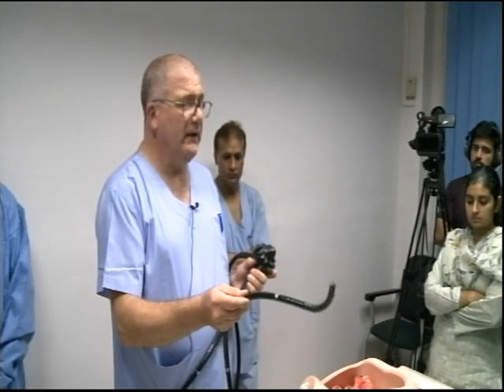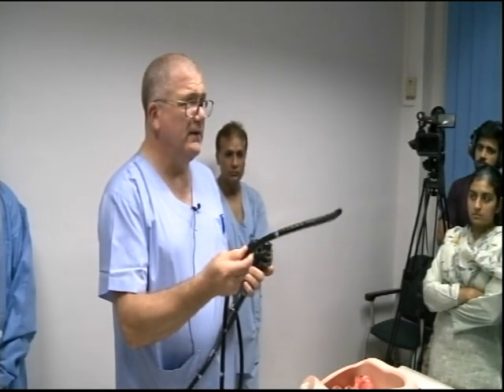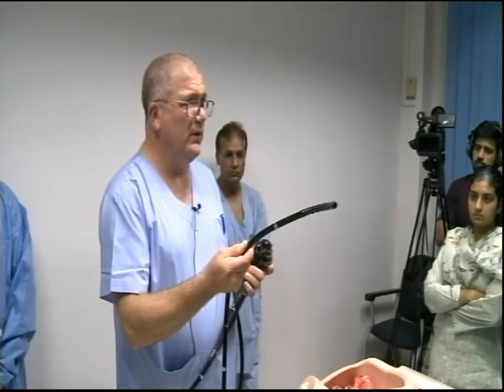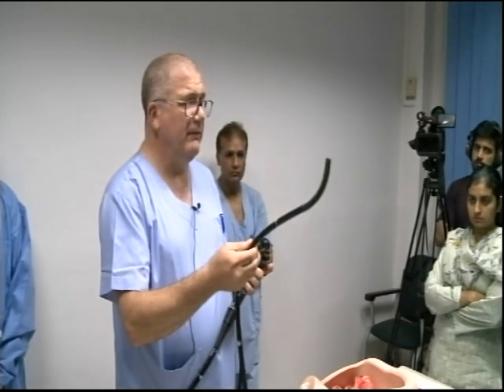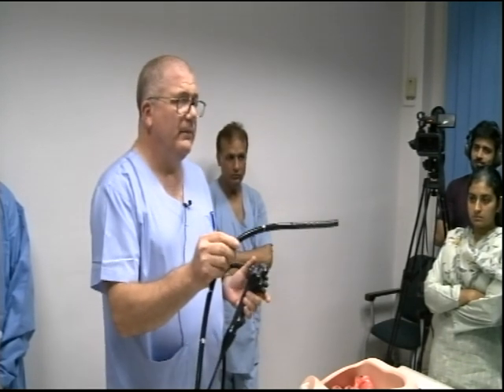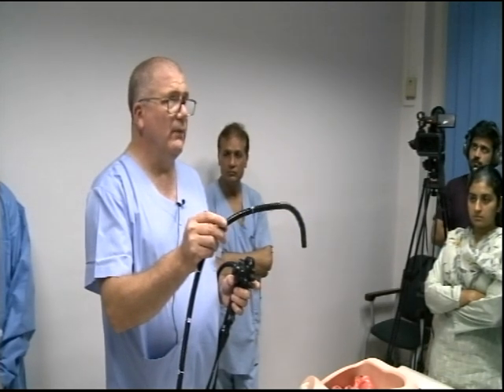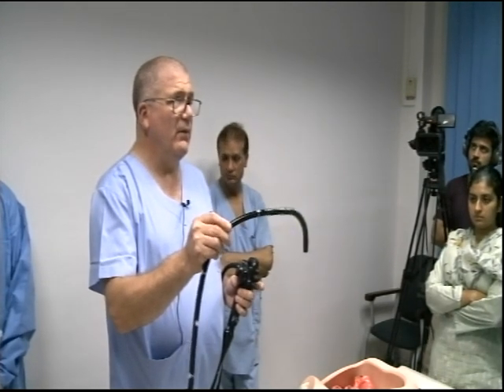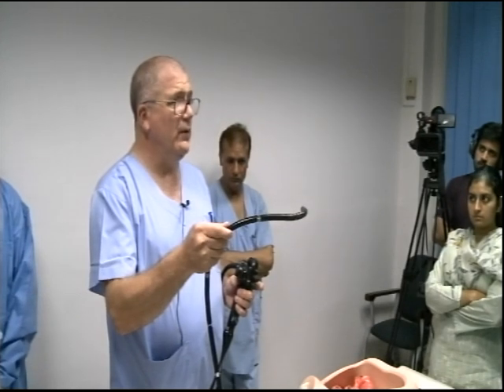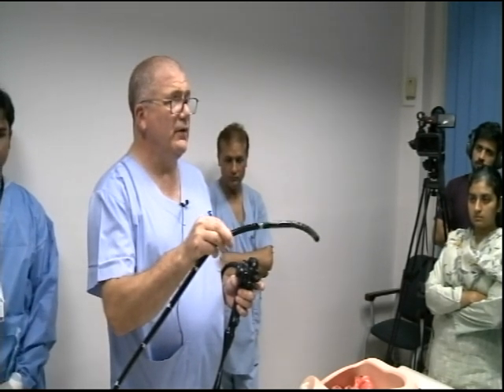So if I've got it here, it's going up, so you understand it's going up. If I want to look to the right, I do a clockwise torque. If I want to look to the left, I do an anti-clockwise torque. Now, if I angulate on the screen and it goes down, which it has done, and I now look to the right, on the screen it looks to the left. So I know what's actually happening to the scope.